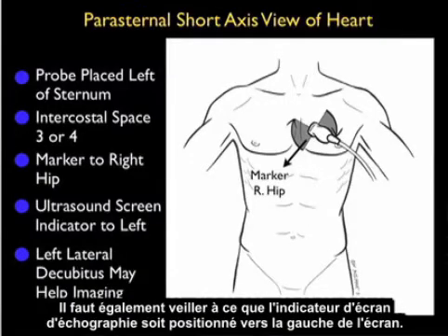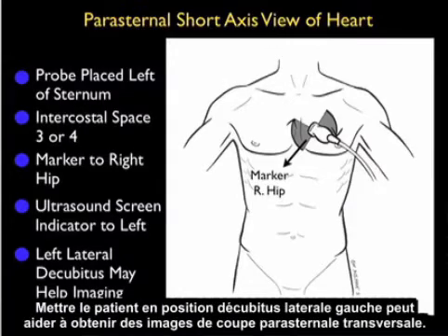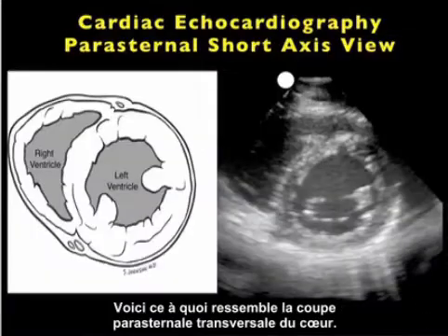That's with the caveat that the ultrasound screen indicator is positioned towards the left of the screen. Moving the patient into left lateral decubitus position may also help imaging from the parasternal short axis plane.